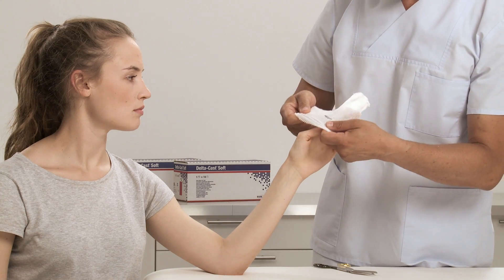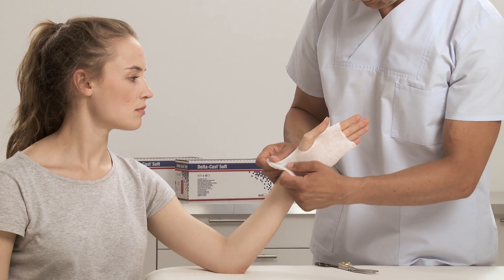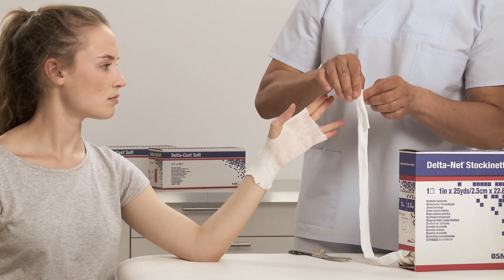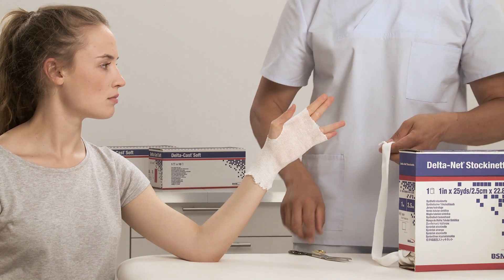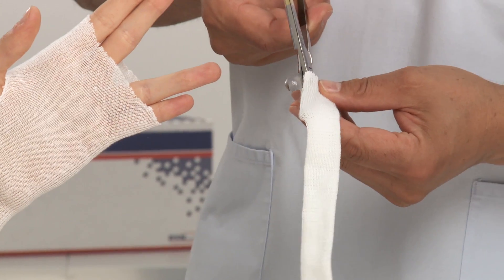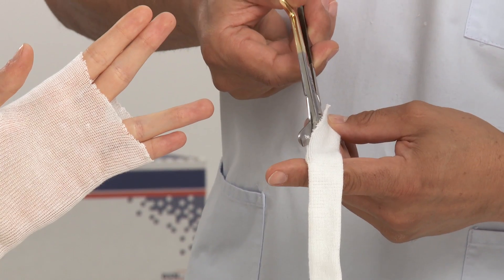Measure where to place the thumb hole and make a small cut with scissors. Roll the stockinette over the hand and wrist and remove all wrinkles and creases. Measure the length of the ring finger with the stockinette, double it, and cut. Make a lengthwise cut and apply the stockinette over the ring and small finger.